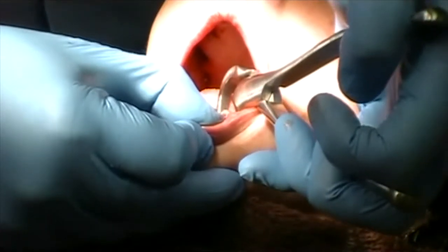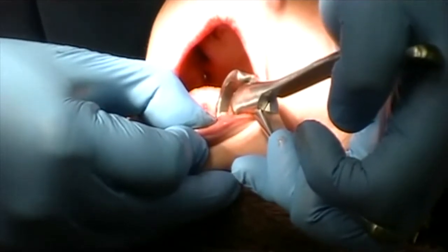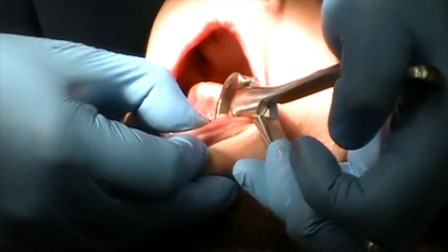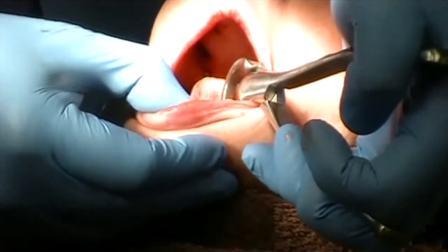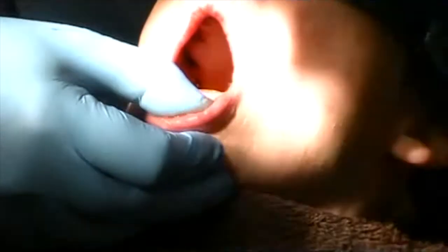You just have to take your time with this procedure. It's time-saving not having to find little root tips. And it's going to pop — I can feel it pop — wow, right out of the jaw.